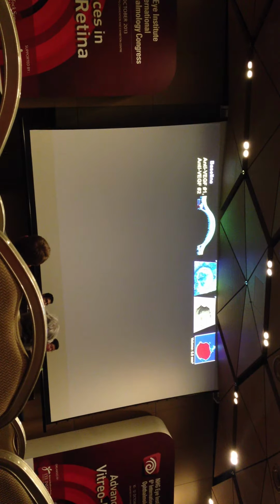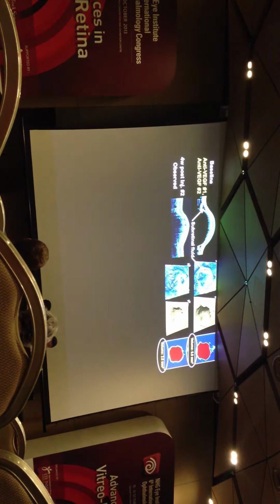So this patient happened to develop wet macular degeneration and receives one anti-VEGF injection, and this visit receives the second anti-VEGF injection. You can see the pigment epithelial detachment, the fluid on the retinal thickness map. Here's the segmentation and the volume. So this patient gets the second anti-VEGF treatment and comes in, and 4 weeks later it looks a lot better. The fluid under the retina is gone.